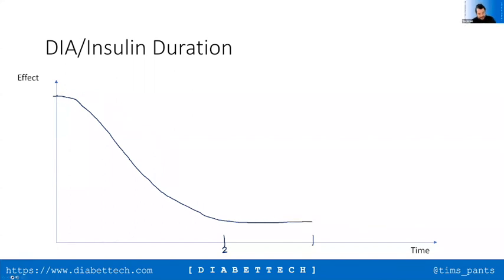So let's call that our 2-hour DIA, and I've now lost my cursor, which makes it a bit more difficult. Now, what happens if we have a longer DIA? Well, we're expecting it to last, let's say it takes something like that to drop off.